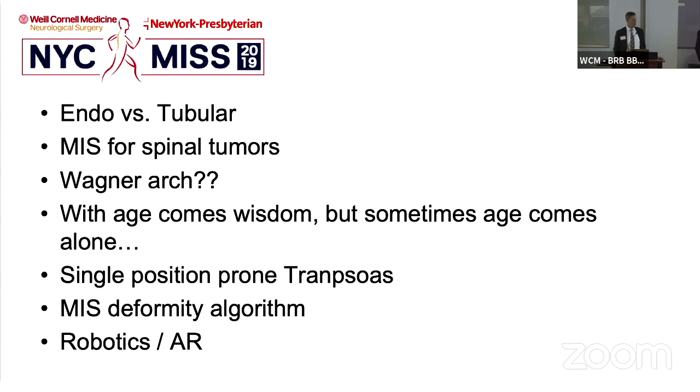Because none of the actual navigation data is out there, except for very few studies that talk about that, because the reality is that most of it doesn't end up where the phantom screw is. It just happens to be a clinically acceptable screw. And that's why the accuracy rates for navigation are still not unanimously 100%.